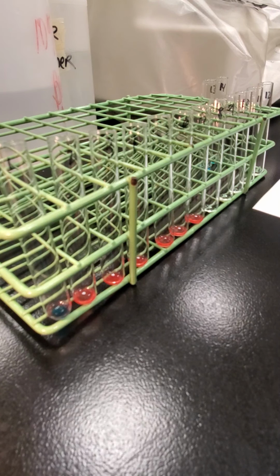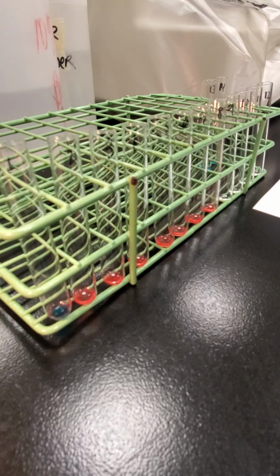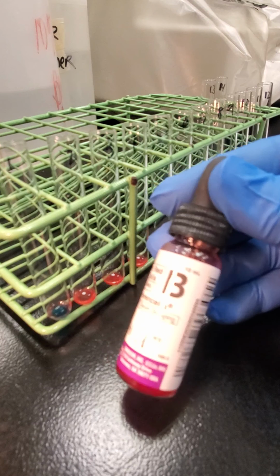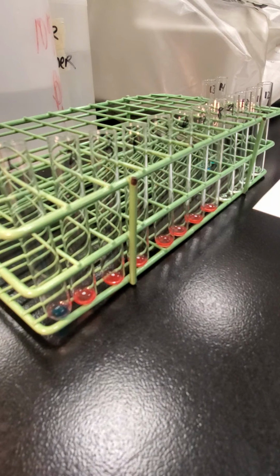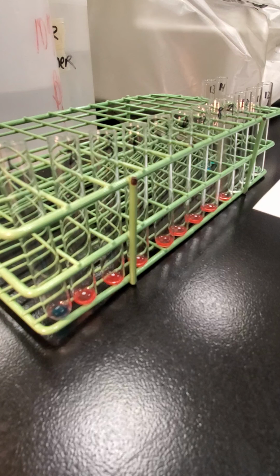So this is testing the reverse part of our ABO. And then to 9, I'm going to add our B cells. Okay, and then 10 and 13.